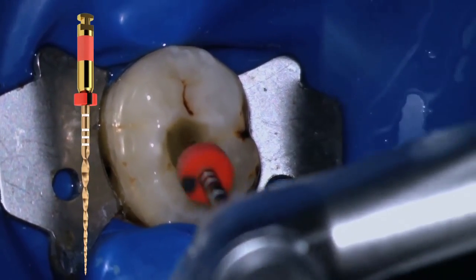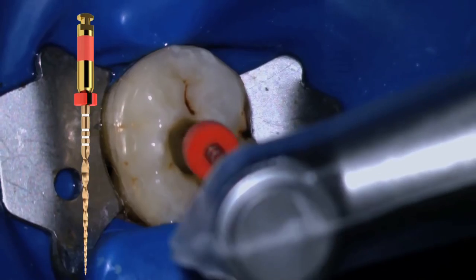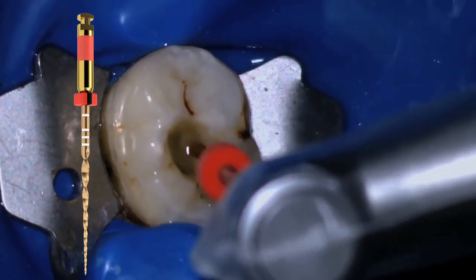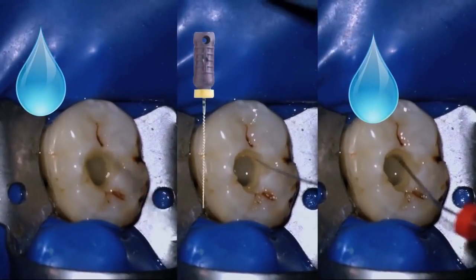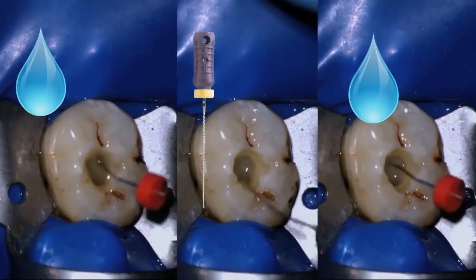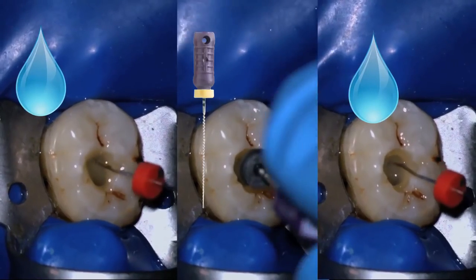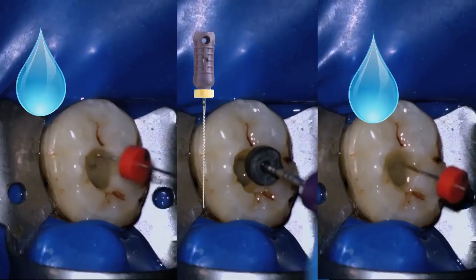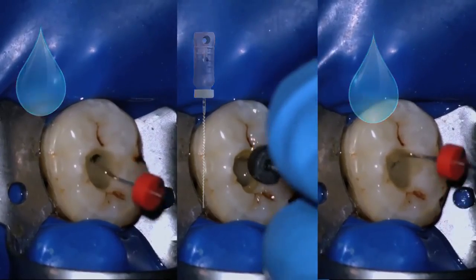Now I'm pretty sure we are preparing the middle of the canal. Amplitude strokes of 3 to 4 millimeters. We irrigate. We make sure that we have not blocked ourselves, and then we irrigate again, and then we continue until we reach working length with WaveOne Gold.